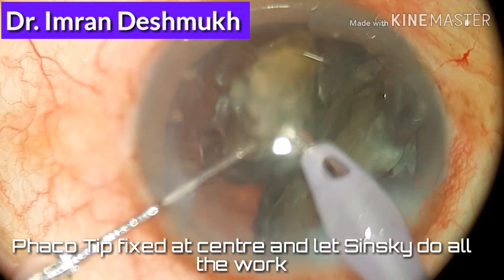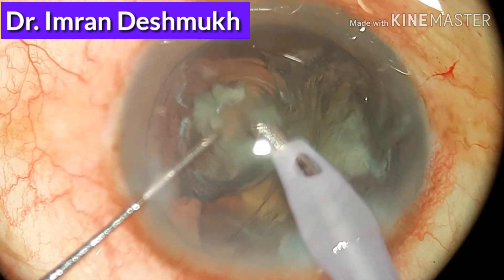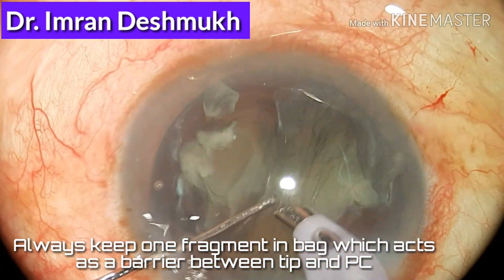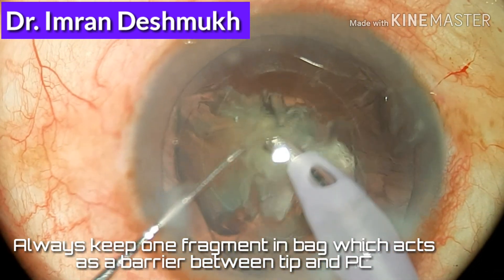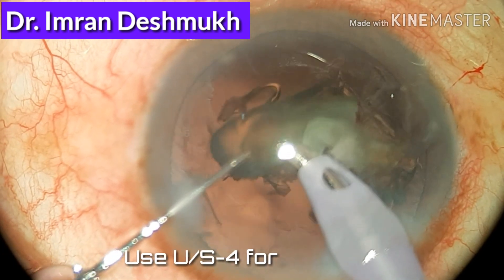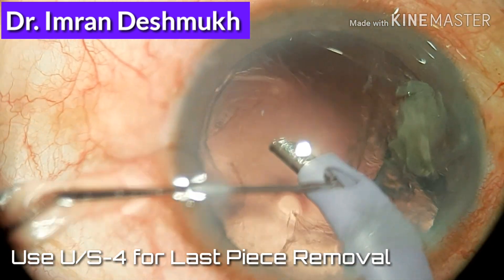Don't move the tip. Use your left hand — the sins key — and all maneuvers should be done with the left hand. In short, the left hand acts as a feeder. You can bring all the nuclear pieces to the phaco tip with the help of the sins key and emulsify. A beginner should always keep one nuclear fragment in the bag, which acts as a barrier between the phaco tip and the posterior capsule in order to avoid complications.